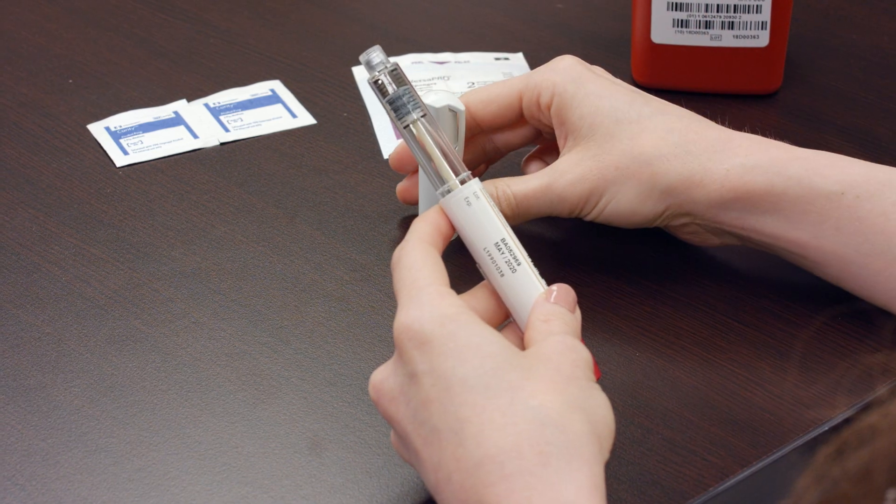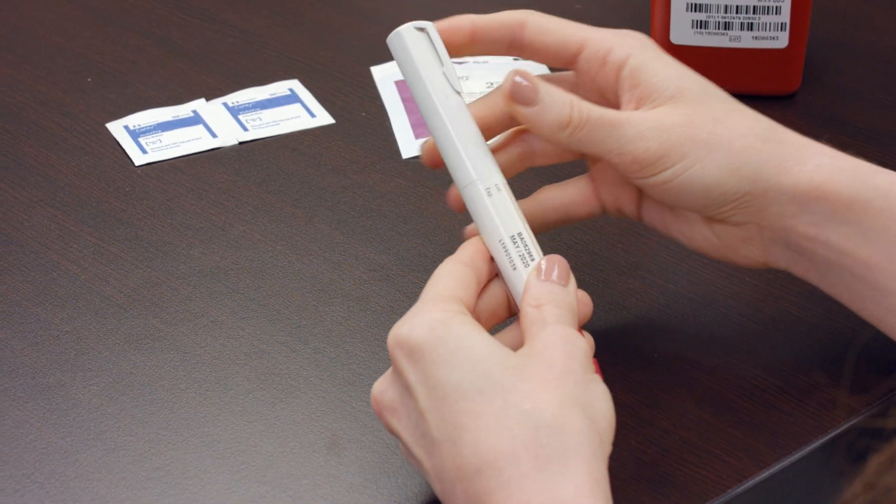If there is medication remaining, place the cap back onto the pen and store the pen.